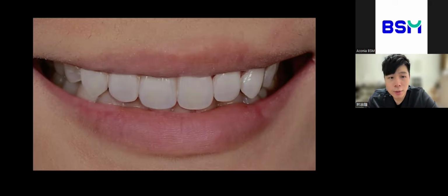Finally, we use the BL4 shaded zirconia as the coping, and then layer on the outside to add more depth and improve overall light transmission. As you can see here, even though we use zirconia as the material, and its translucency is not as high as glass ceramic, layering can really solve this problem in some cases.